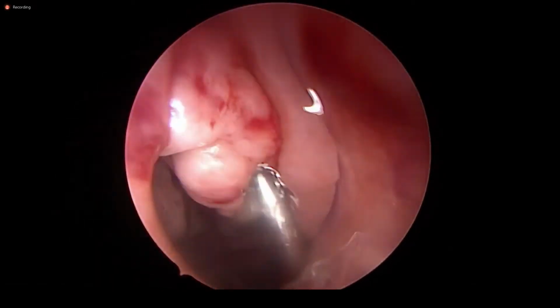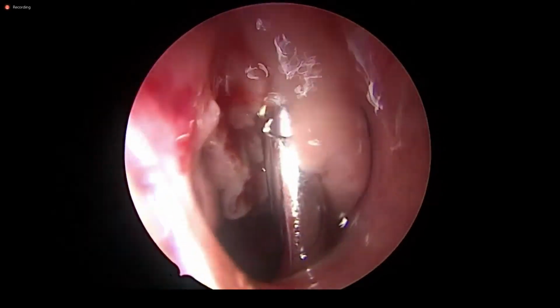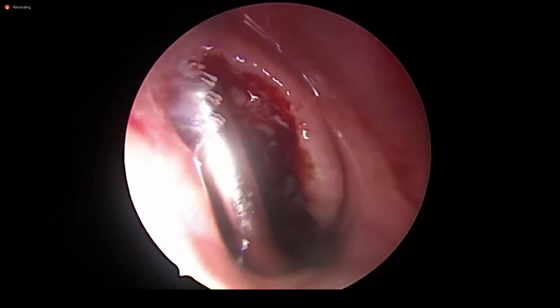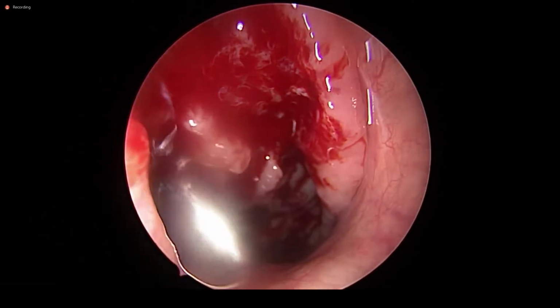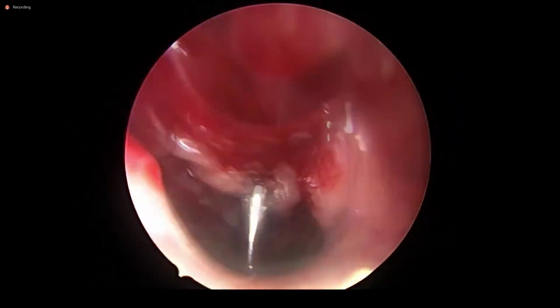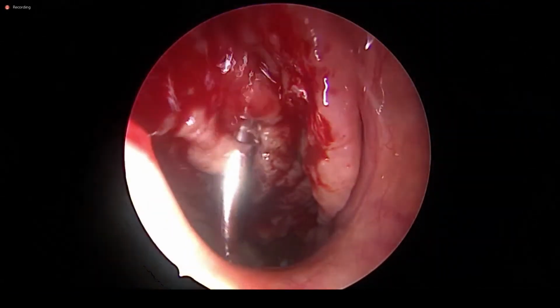See this. I will accomplish this removal of the tissue very fast, as the bleeding is going to happen a little bit. So I accomplish it very fast and remove this surface adenoid. Gross removal. Can you see this? Yes, sir. It has to be very quick so as to minimize the bleeding.